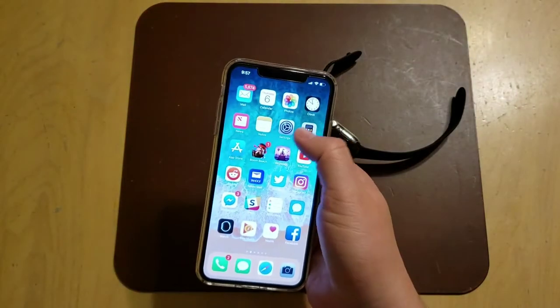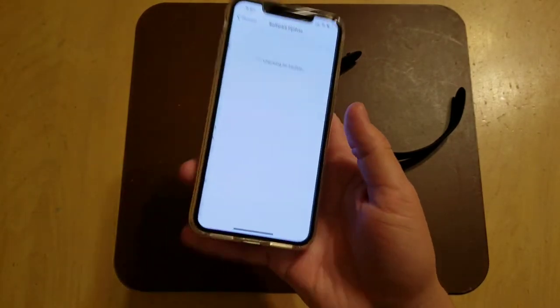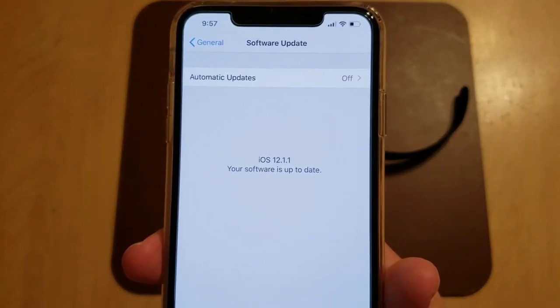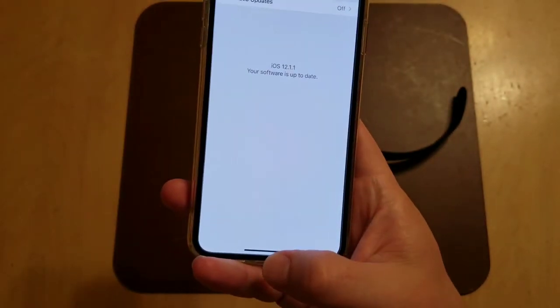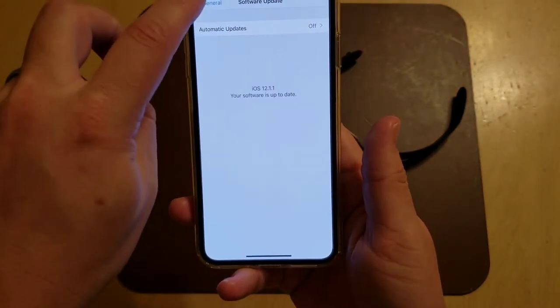You also have to have the latest official release on your phone. Go into Phone Settings, go to General, go to Software Update, and make sure you're running iOS 12.1.1. These are the two things — it has to be the official release. I was running the beta profile, and I ended up having to delete the beta profile to get the ECG feature to work.